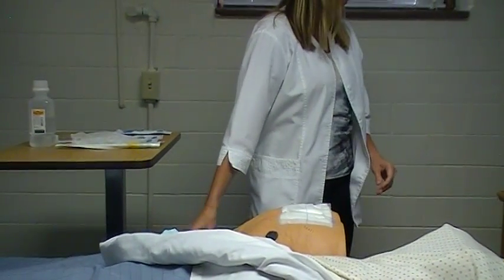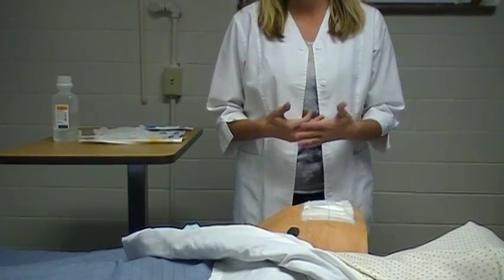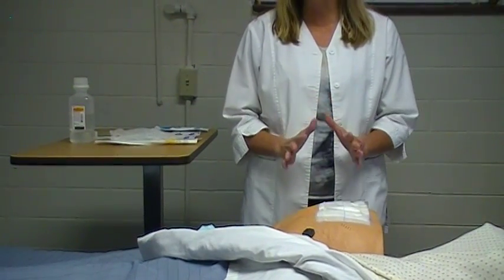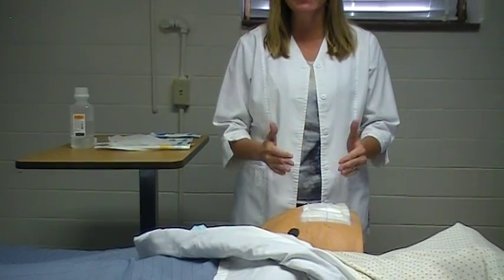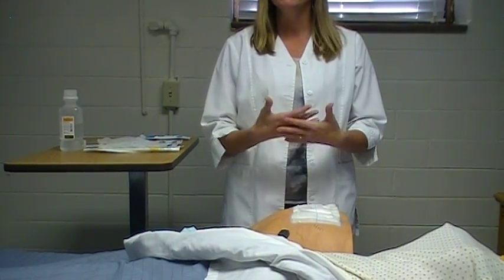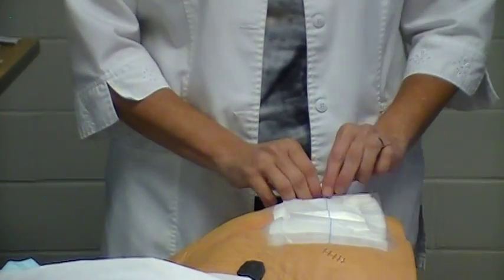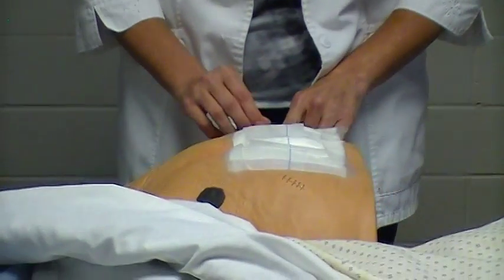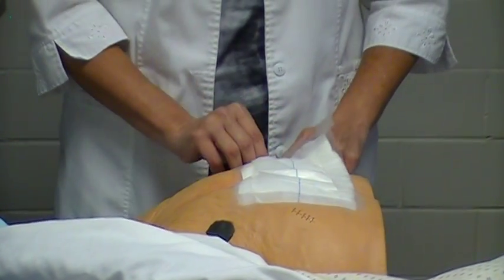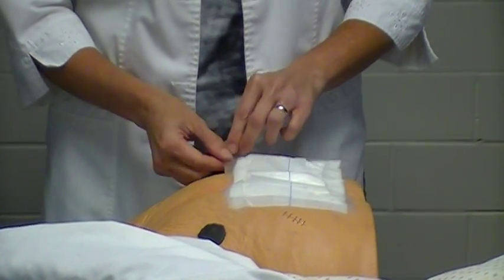The next thing that we're going to do is loosen the tape up on the old dressing. Now, your skill book does not require you to have gloves on at this time. However, if your wound has drainage and you see visible drainage on the old dressing where you would be loosening the tape, you would put gloves on at this time so you did not come into contact with any bodily fluids. You may also need to use or can use an alcohol pad to help loosen the dressing up. Now, I'm not going to do that on this one, but if you needed to, you can.